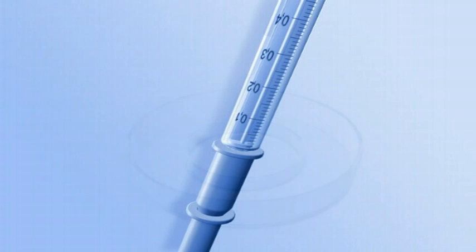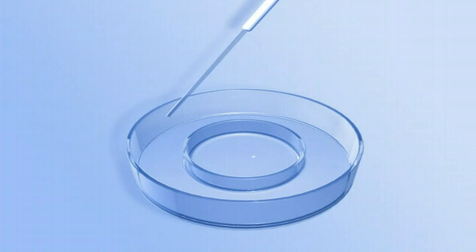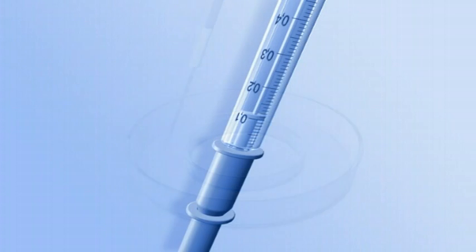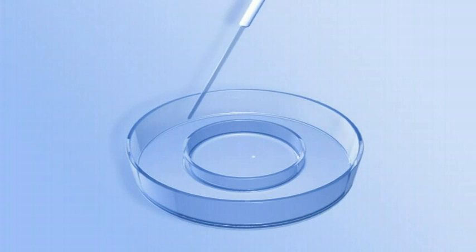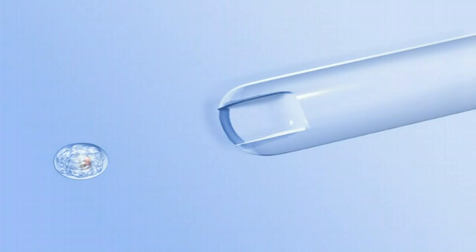After rinsing, draw approximately 0.1 milliliters of embryo glue from the well and expel into the moat until 20 microliters is left in the syringe. Gently load the embryos into the catheter in 30 microliters of embryo glue.